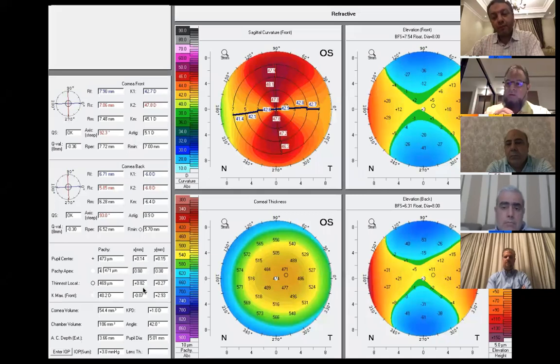And sometimes you may be astonished. If we add some high order aberrations to the profile, you may find that the ablation depth is becoming less than the optimized, because some high order aberrations like trefoil are peripheral high order aberrations, so they will reduce the ablation depth in the center.